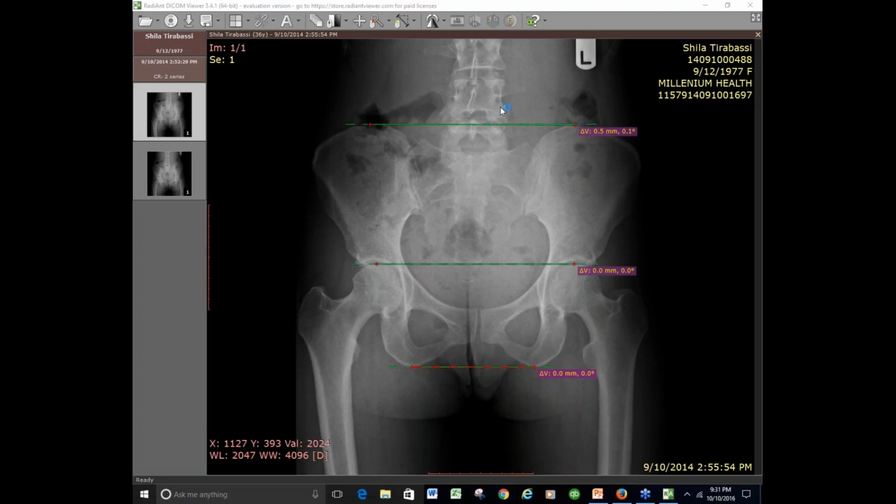Well, the fusion certainly is right above the hips. All of this is really looking at the pelvis itself. Well, I'm saying if they have a leg length inequality, can you, because that's a big contraindication. You said if they have a fusion, don't put a lift in there, but if he's got a short leg. Like this last guy who had an 18 millimeter difference, or Sheila who had an 18 millimeter difference, correct them. You may not be able to correct them the entire way.